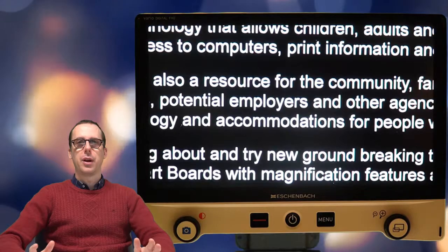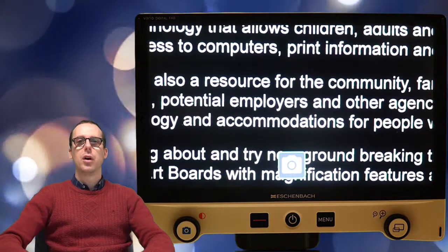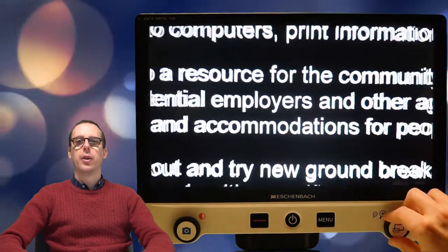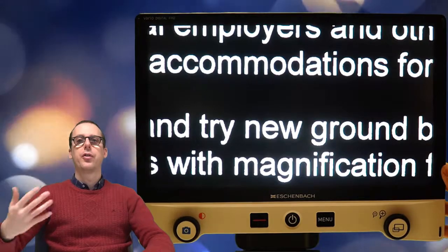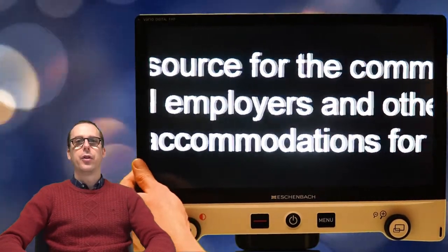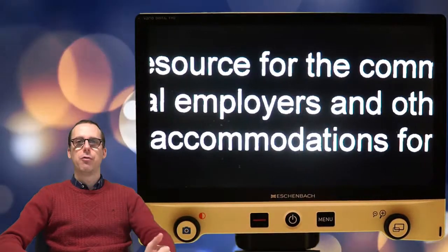Now, in the middle of the color change dial, there is a button as well. This is the photo button, but it actually has two functions. If we press it once, it's going to take a picture, like a freeze frame. Once we've taken a picture, we can zoom in on the picture. We can change the color of the picture. And so that's all good. And then when we press it a second time, it's going to take us back out to the live magnification mode. The other thing that it does, though, is actually we can hold it and choose a reading mode.